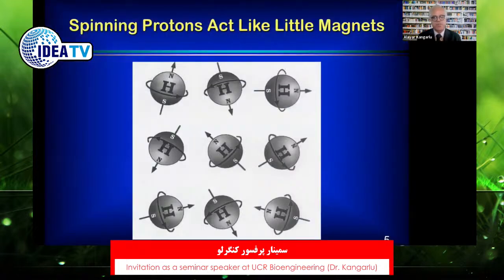And this is how protons look. These are the hydrogen atoms in our body. As you're sitting wherever it is that you're listening to this talk, the protons of the hydrogen atoms are rotating in random directions, and the random directions give the magnetic field a random distribution in space. By the way, the protons are rotating right now. Your protons are rotating because they are precessing.